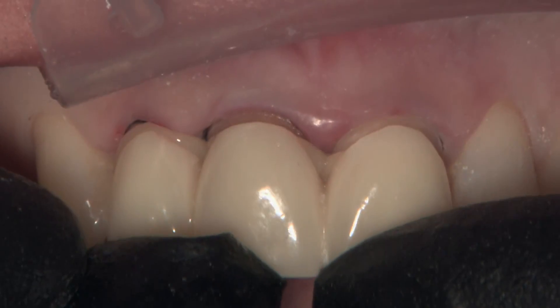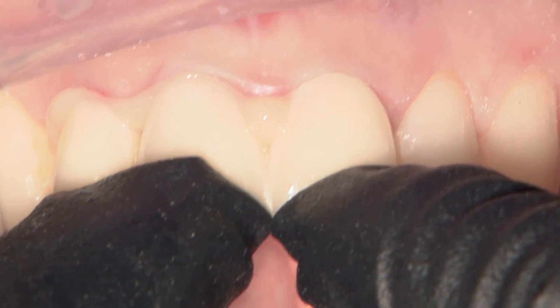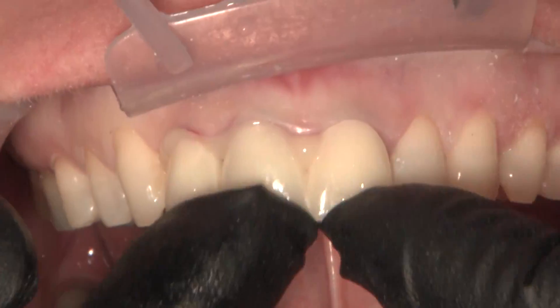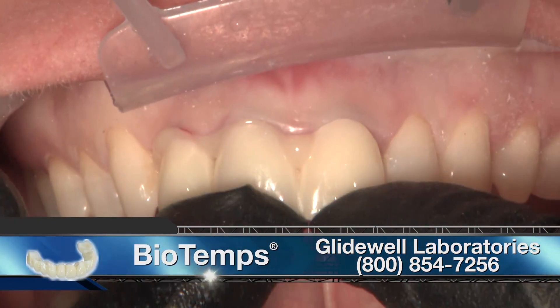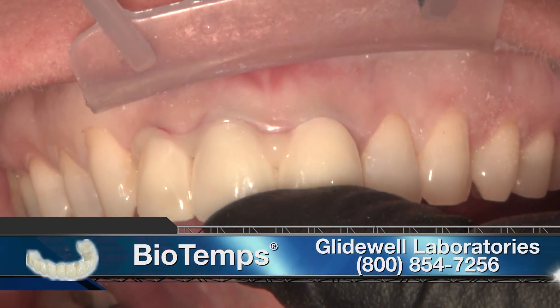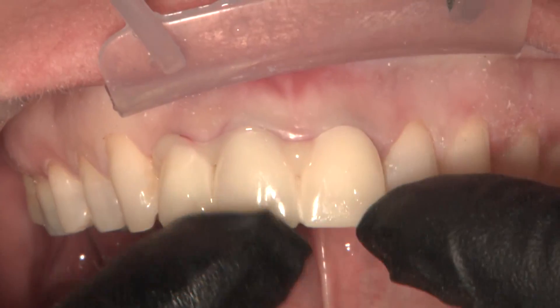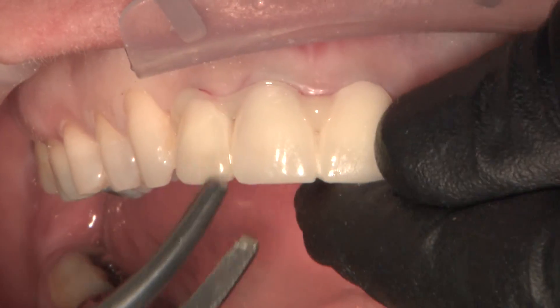Tooth number eight actually has a much lower value compared to tooth number nine. We're going to fit the biotemps now, get them all trimmed up and put them on. And then we're actually going to do a little walking bleach technique with this patient to get that prep value a little bit lighter so it comes closer to matching tooth number nine.